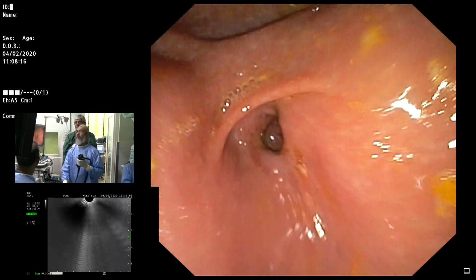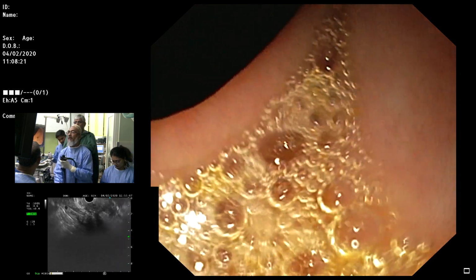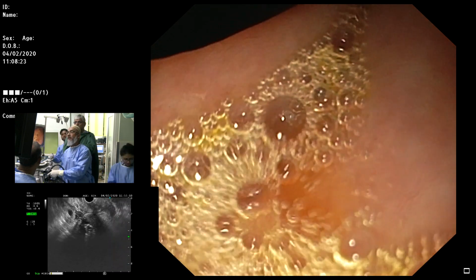So, you can use the small wheel sometimes to get in. So when you get stuck, yeah, here, just use the small wheel a little bit.